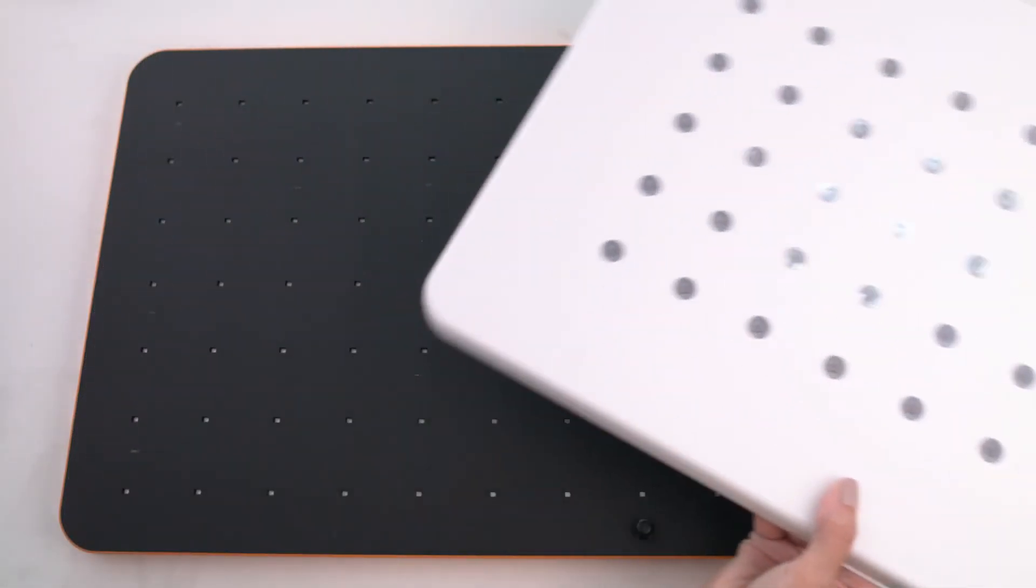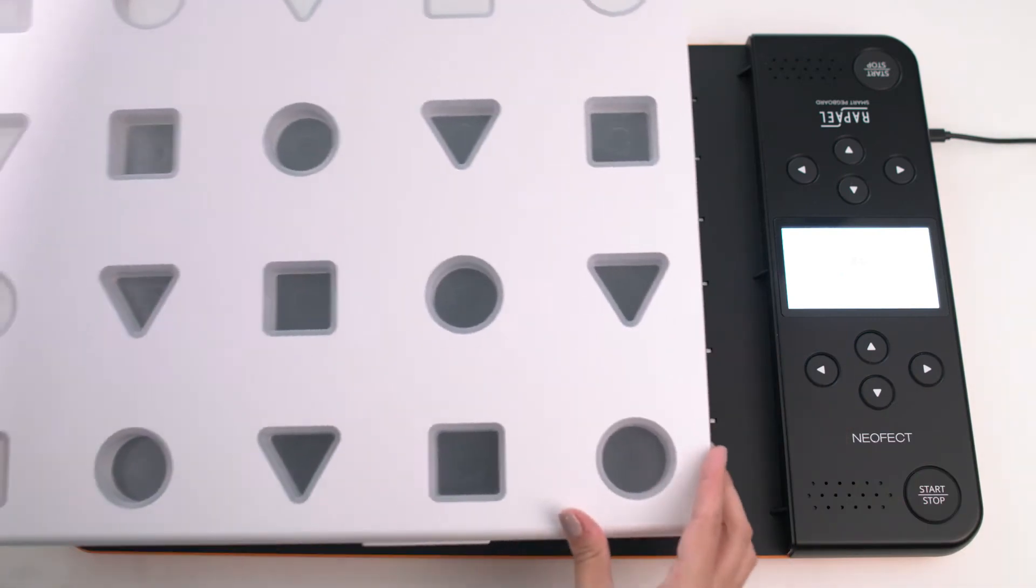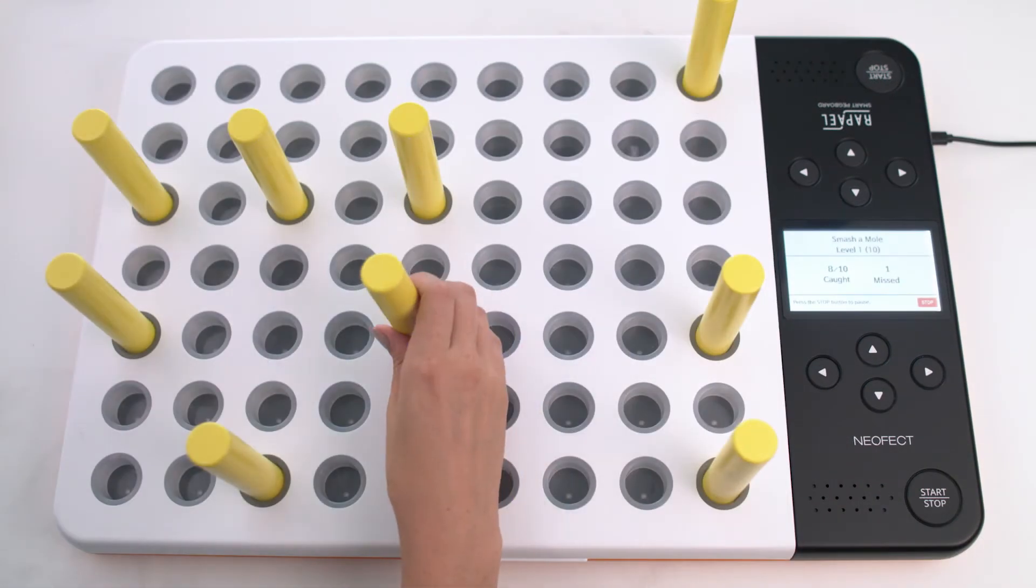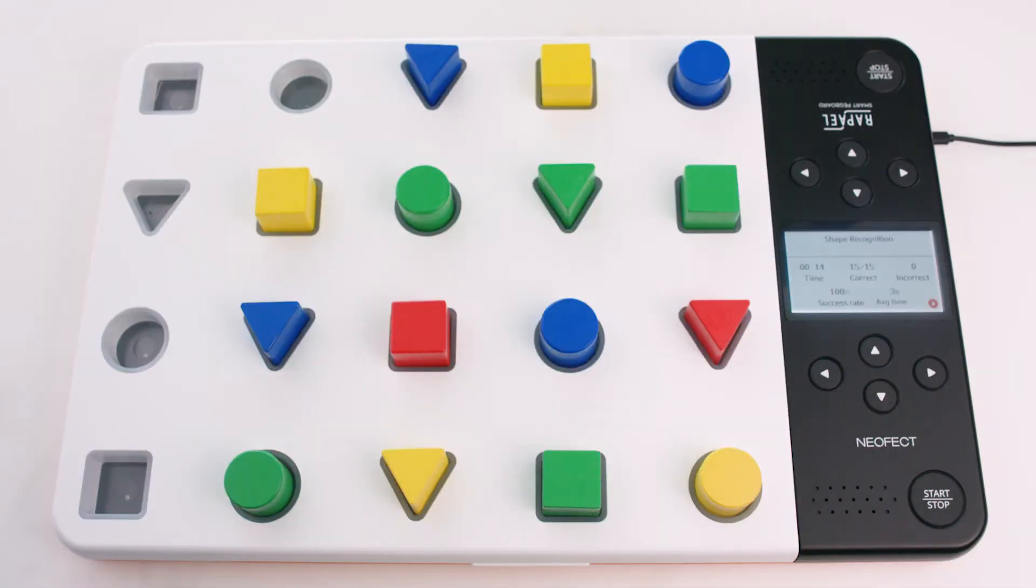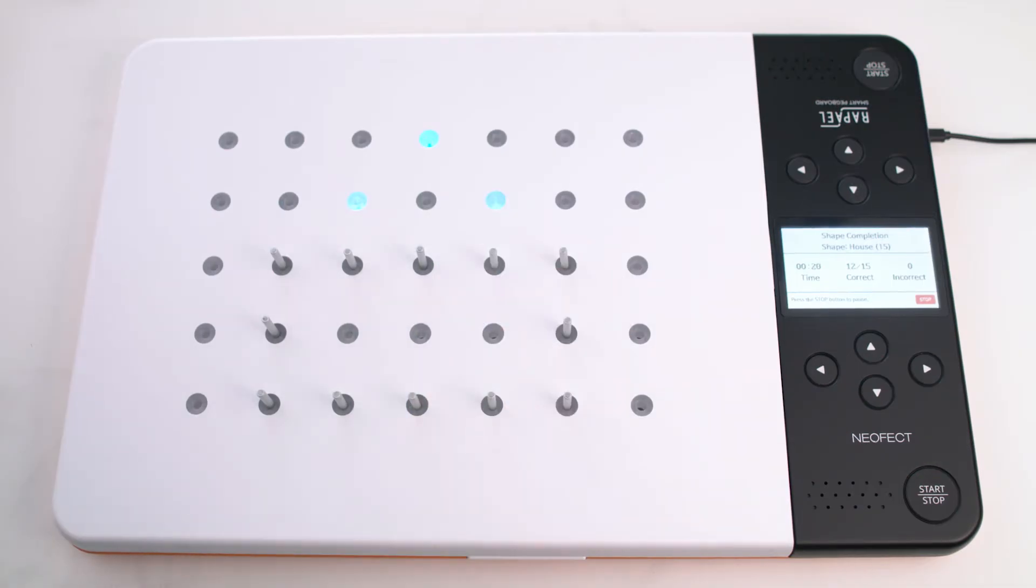The Smart Pegboard system is made up of three interchangeable boards including the standard board, mixed shape board, and pinch board along with the corresponding pegs.